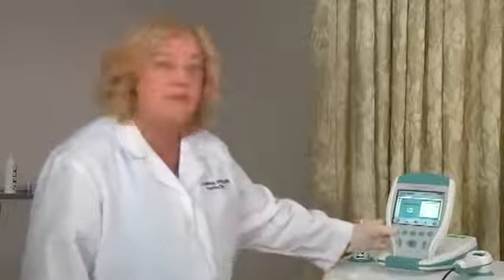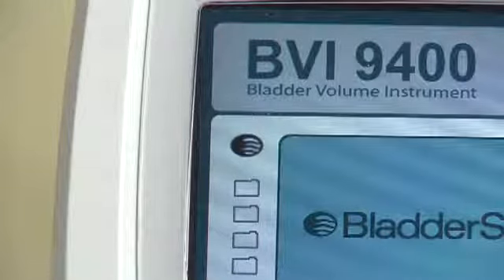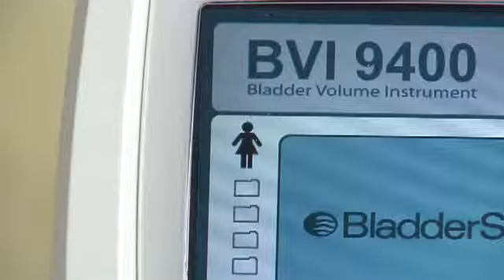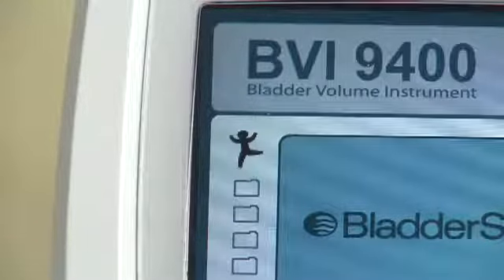To begin, first select the proper exam mode to ensure the accuracy of your scan. Press the mode button repeatedly until the right setting appears. Select to scan a male patient or a female patient who has had a hysterectomy, a female patient who has not had a hysterectomy, or a small child under 48 inches (122 centimeters) tall and weighing less than 60 pounds or 27 kilograms.